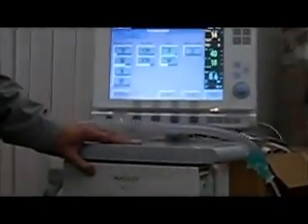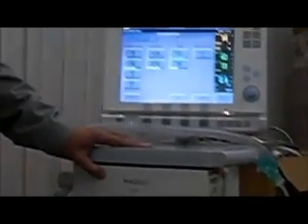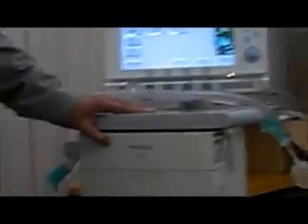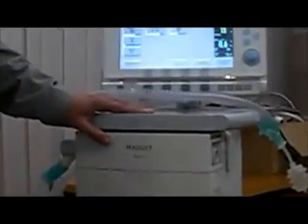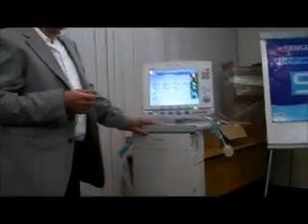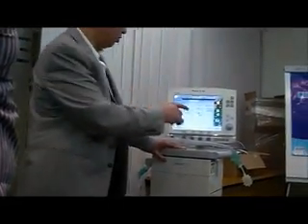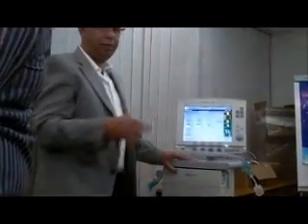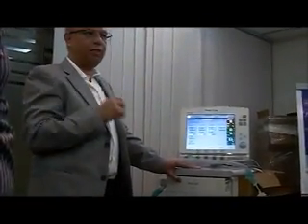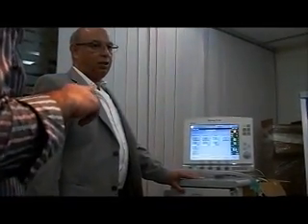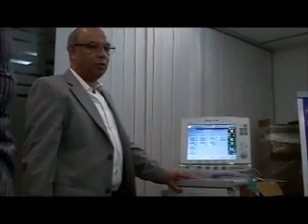So, are these reasonable settings or unreasonable settings? I think the PIP is low. Okay. So how do you decide on a good PIP? By chest expansion. Chest expansion is one thing. What else? Good air entry. Air entry, chest movement. Also, all the new ventilators will give us tidal volume. You want to look and see how much tidal volume you're getting — not too high, not too low, just like with PIP. So it's starting before the x-ray; these are your initial settings.